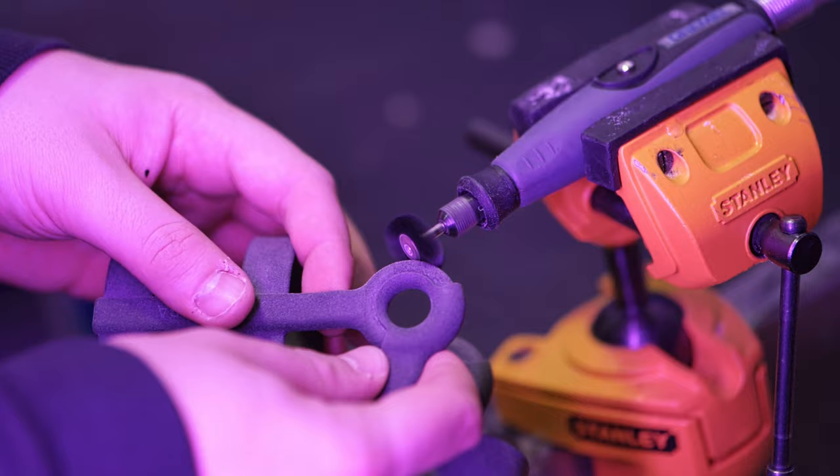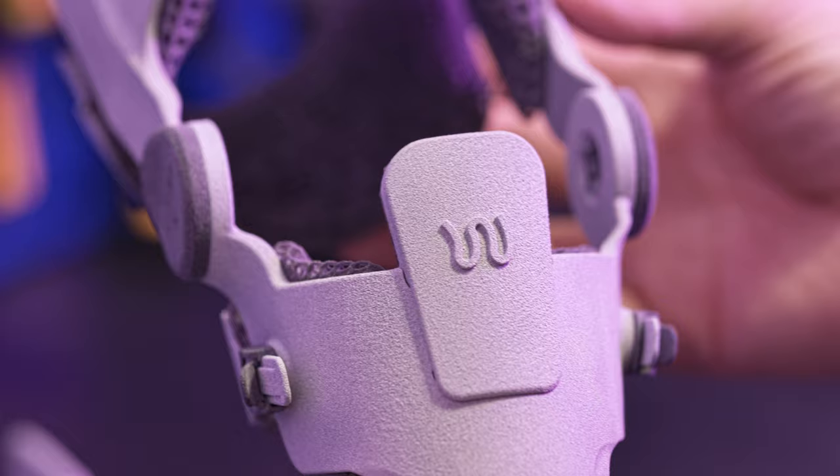Assembling each brace with precision ensures it meets the highest standards. Our aim was to create a product that addresses mobility issues related to the injury of the ligament in the stifle — a product that not only exceeds clinical expectations but is also functional, easy to use for the owner, and comfortable for our patients.